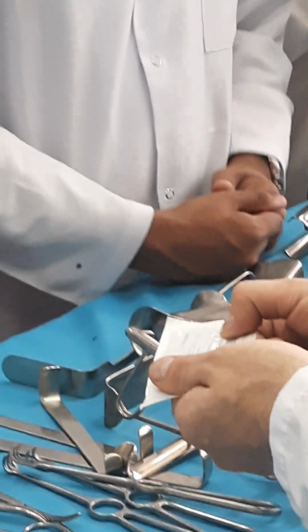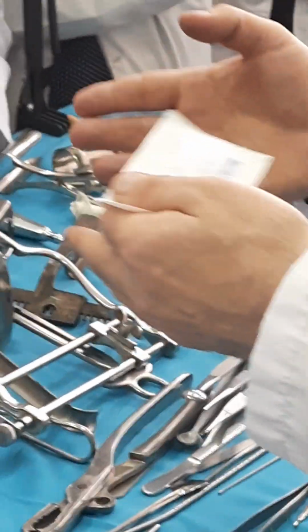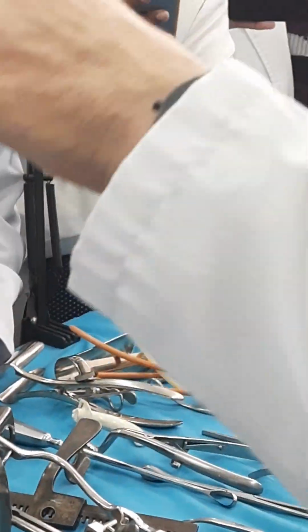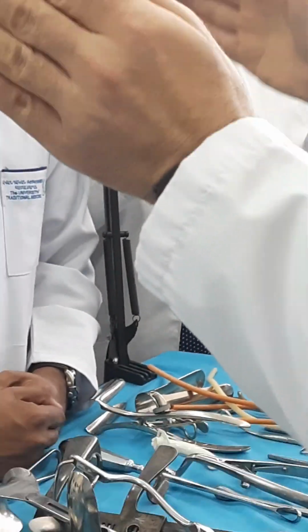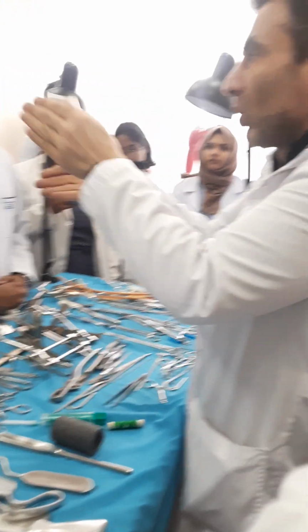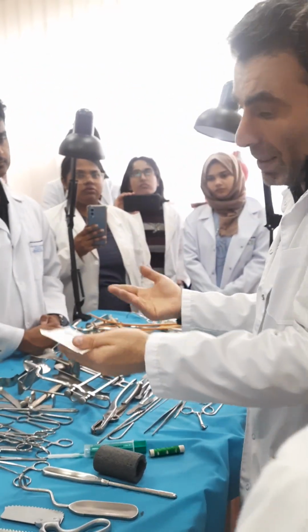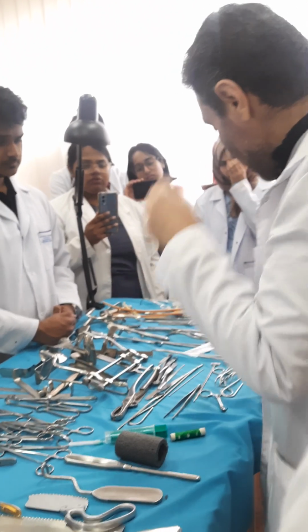So all the information, metrical system, even metrical size 3.0. So everything is given. What does it mean? For example, 1/2 of the circle, it is semi-round. Or it can be 2/3 of the circle, more curved, or vice versa, a less bow-shaped form. Yeah. So everything is written.